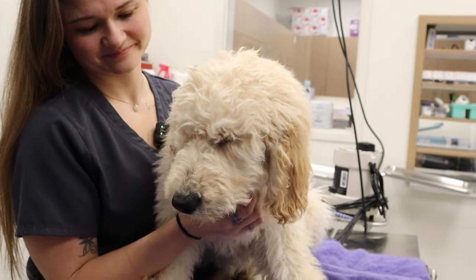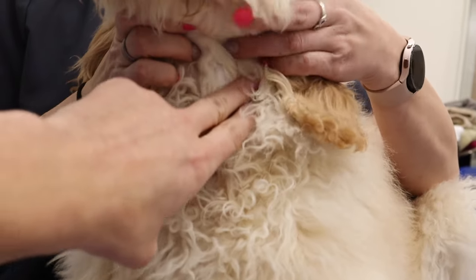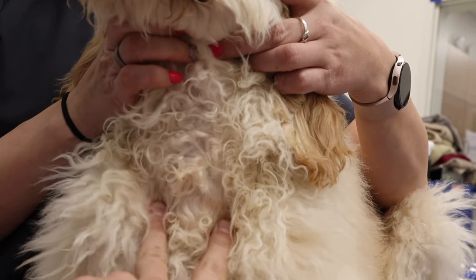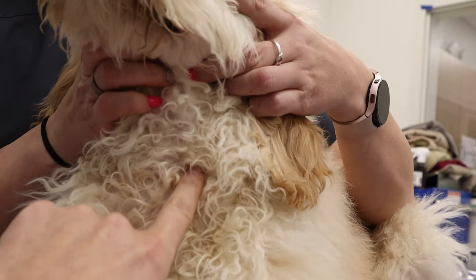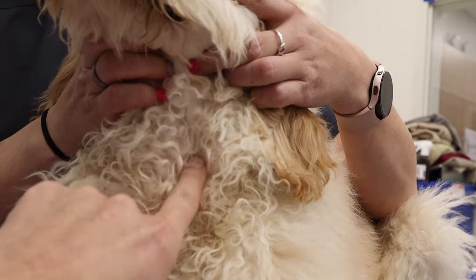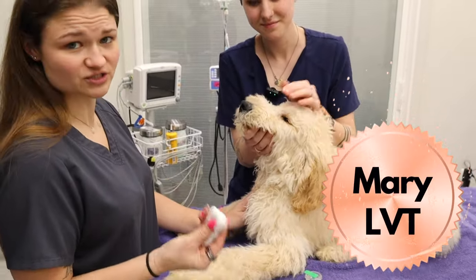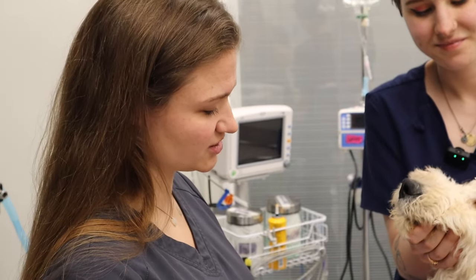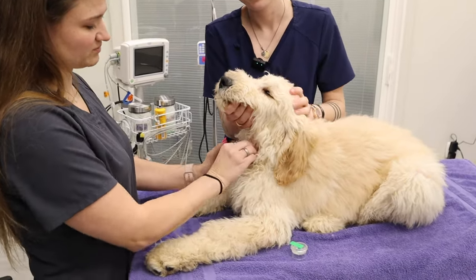As promised, we're going to do a jugular poke. Right down here we're going to have the jugular — one over here and one over here. What we're going to do is apply gentle pressure to either side, and that's going to allow the blood to pool up here and then we can poke and get a blood sample. The first thing we're going to want to do is take some alcohol — you can put it on a gauze or spray the neck down a little bit. This makes it a little gentler and less fearful for them. We just put it on a square gauze and wipe it down.